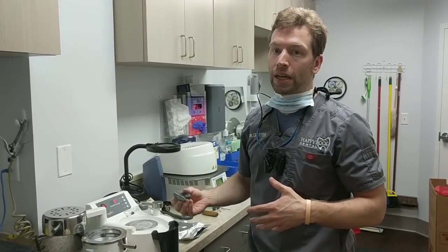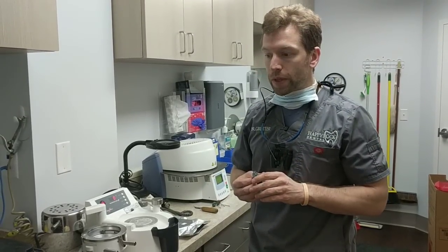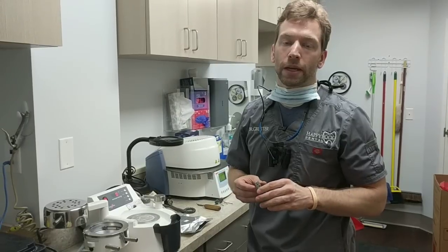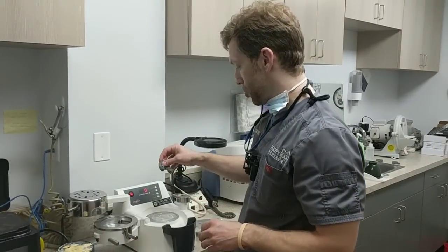If you're doing aligners, I really encourage that. You can do bleaching trays and maybe final retainers with a suck down, but Glidewell's Erkoform is probably one of the only ones you can get good adaptation with a suck down. There are also a couple of rollers out there — the Drufomat and the Drufosmart, which are both Dentsply machines.